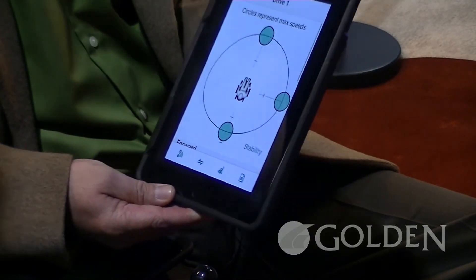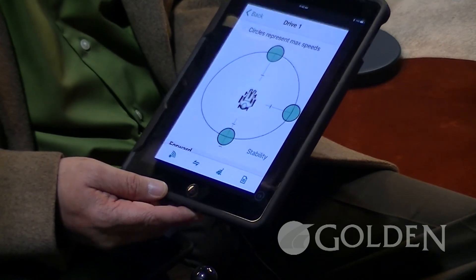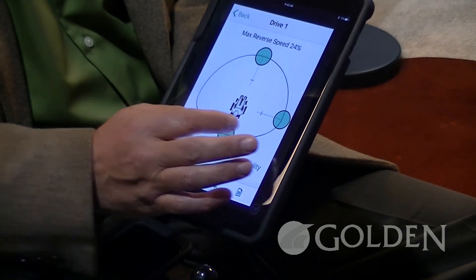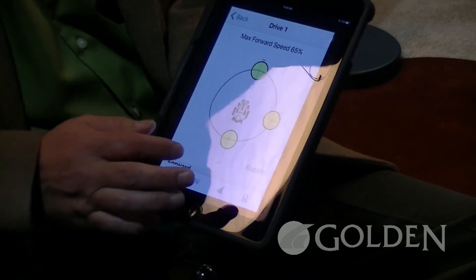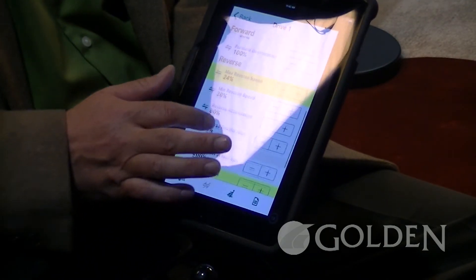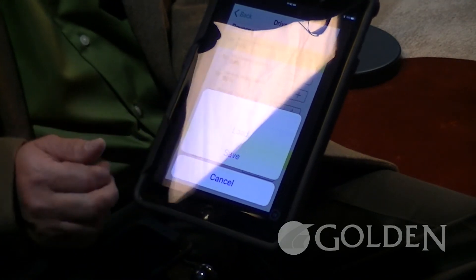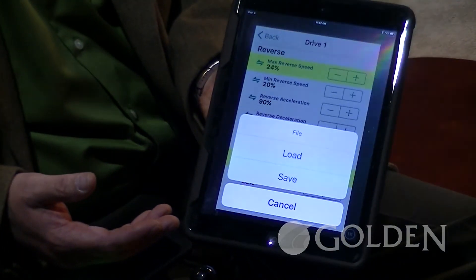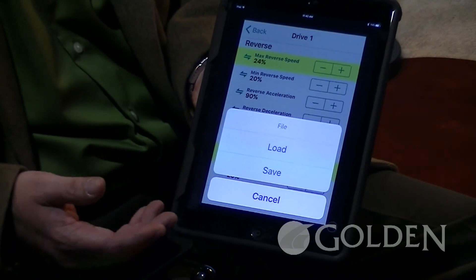For a person with a progressive diagnosis, when we want to save the settings, we'll go to arrows and everything that we do is actually being set into a filed setting. We go to scroll and then save. Any changing of the parameters is actually going to be saved on a file, and this can be shared with the clinician and the technician.